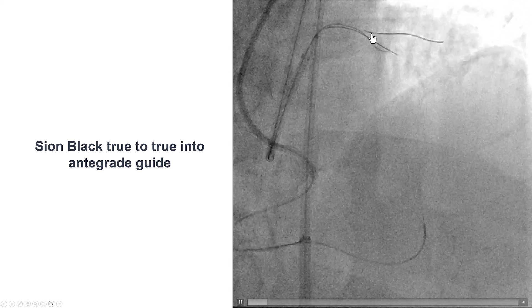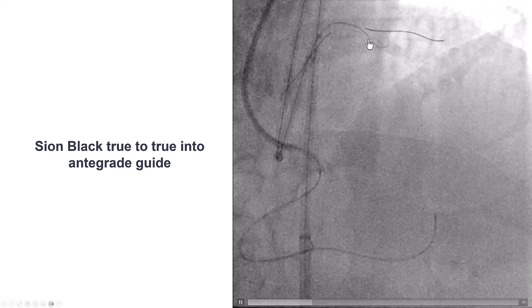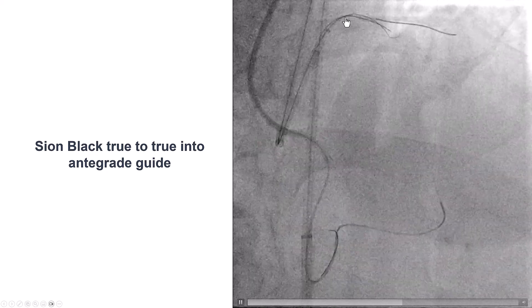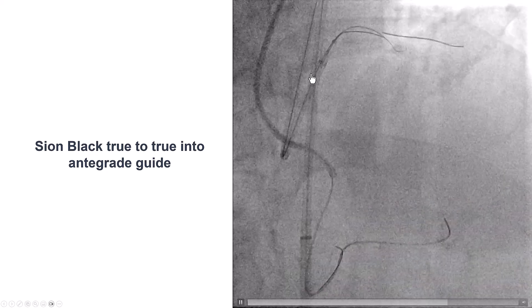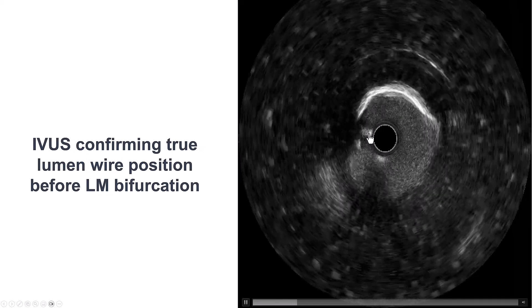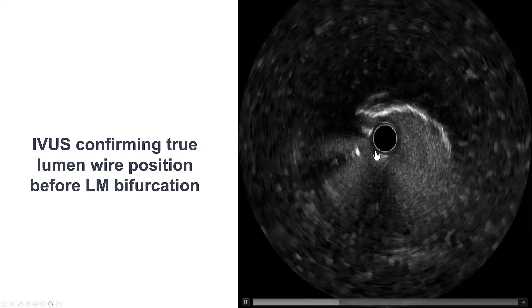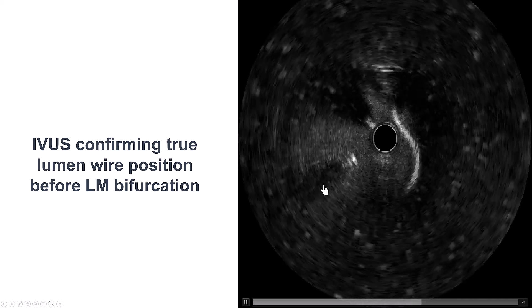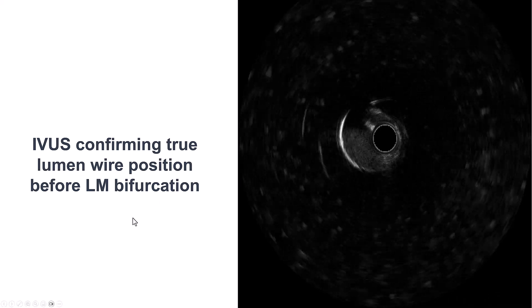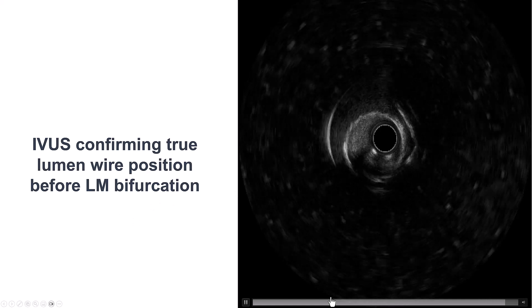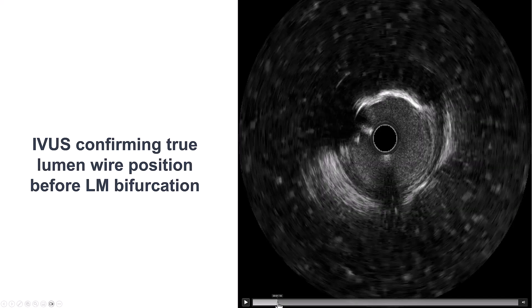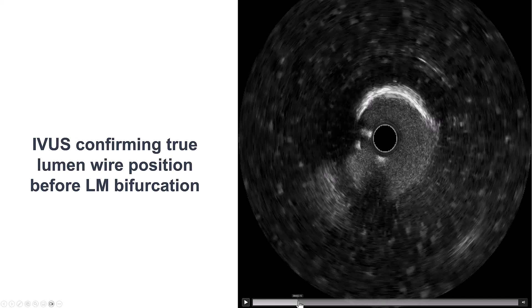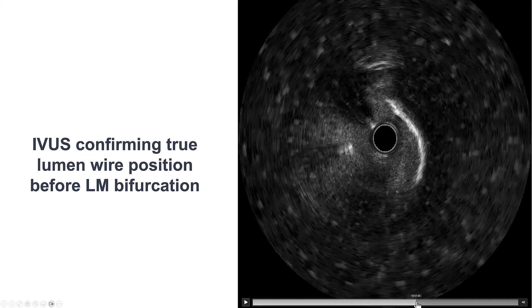We could use the guide extension because we want to make sure we do not have re-entry close to the left main, which could compromise its integrity. Before doing any PCI, we want to confirm where the wire enters the true lumen — because if it is in the left main or close to the bifurcation, that can be devastating and lead to loss of branches. The wires were confirmed to be in the true lumen inside the LAD before reaching the left main.